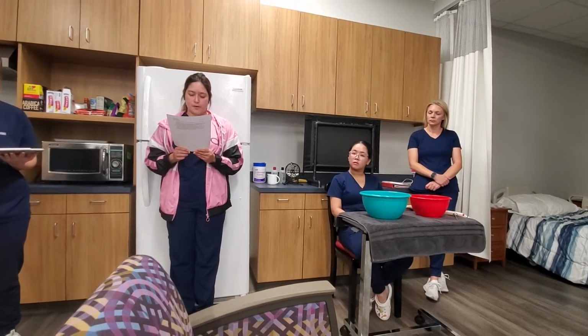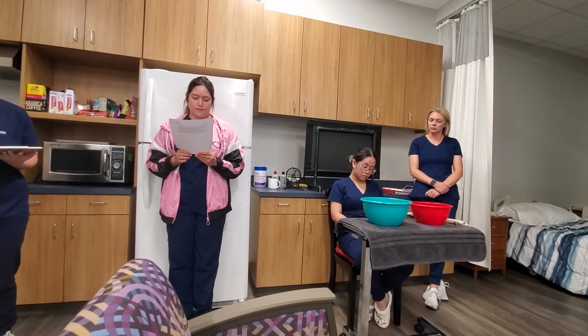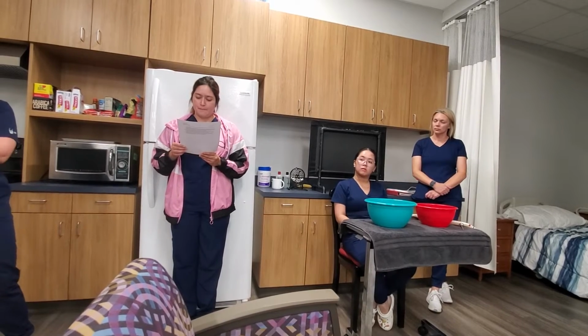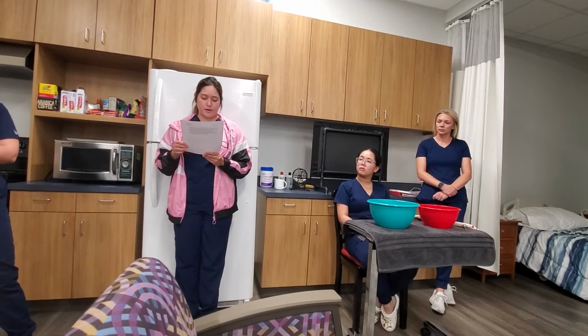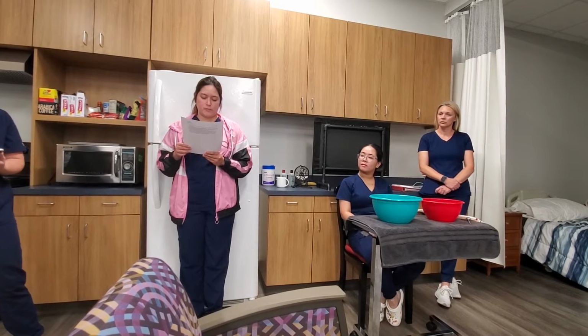The goal of using a physical agent modality such as contrast baths is to improve the client's ability to perform occupational functions. The practitioner is then able to involve the client in functional activities that may have otherwise been far too difficult to perform. The use of PAMs without application of functional activity is not considered occupational therapy.